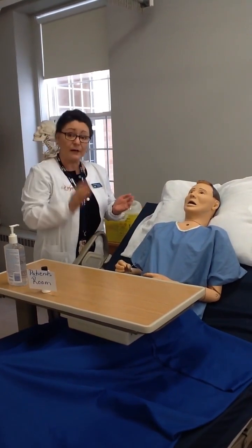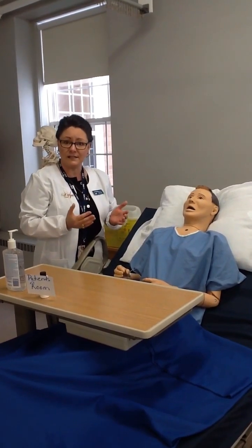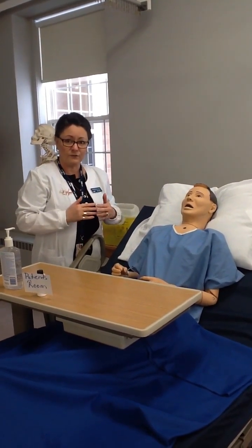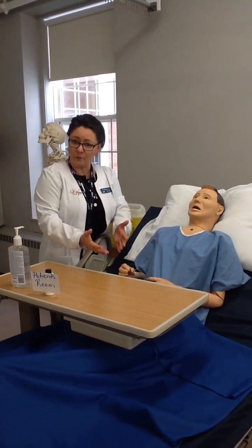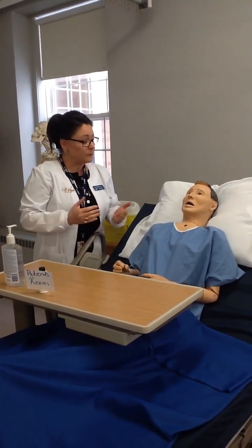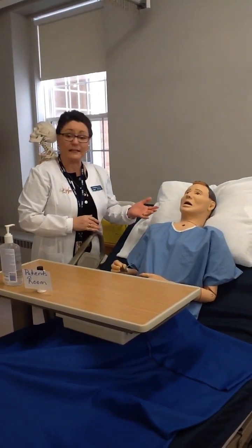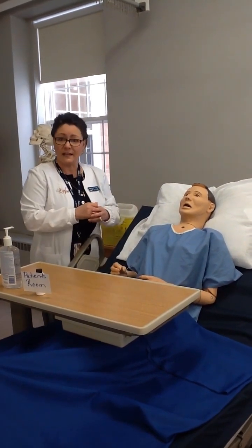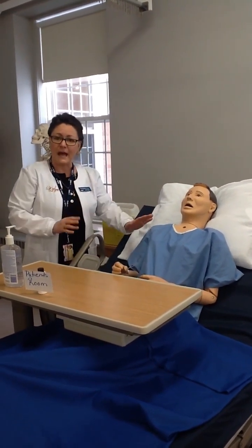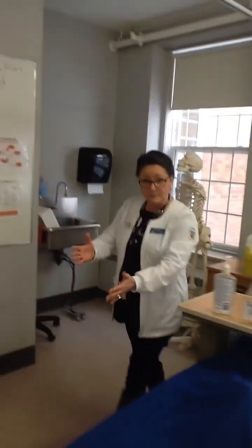And then I'm going to ask him if I can please take his blood glucose reading so that I can know whether he's in a safe zone or not for me to administer this injection. And so I'm going to proceed with that skill, and then I'm going to ask him if that's okay. Can I proceed and go fix your insulin? And he's going to either have the right to refuse or he's going to consent. And so Jesse consents, and when I'm happy with all that and he's happy, I'm going to tell him I'll be back in a few minutes. I'm just going to go prepare your insulin, and I'm coming back to my med room.